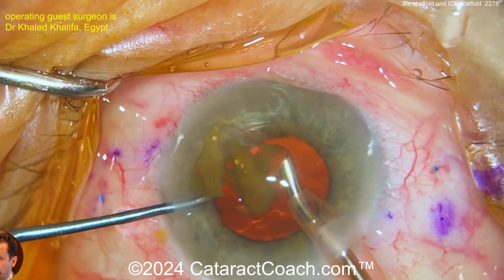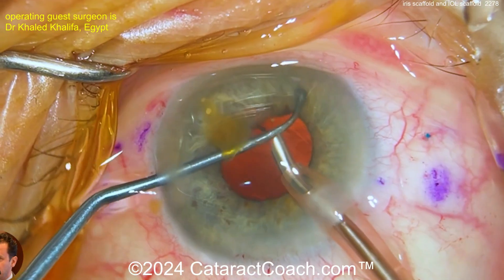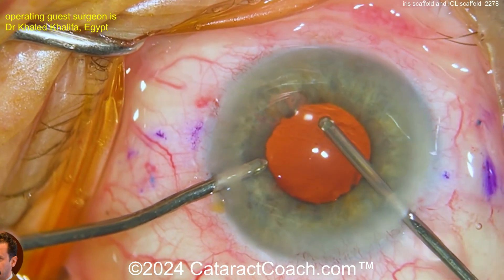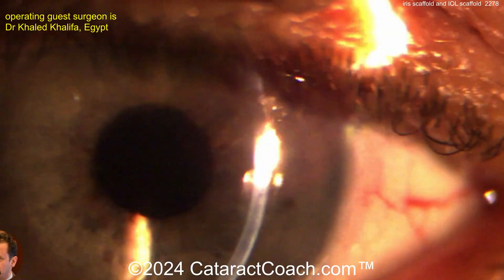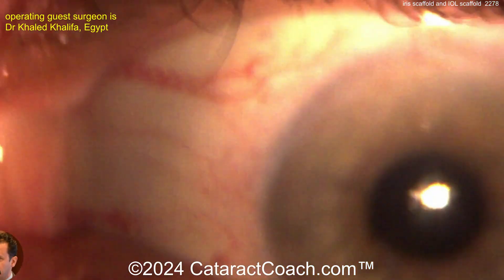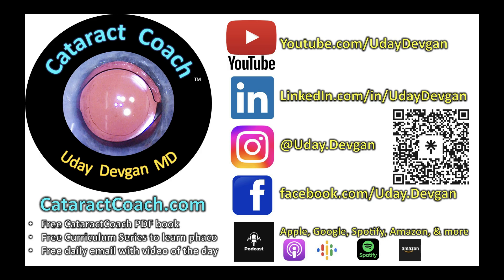So again, scaffold technique here — emulsifying all these pieces. Looks really good. Here's the last piece coming out. Careful to protect the iris — good job. A little bit more anterior vitrectomy. Be careful doing anterior vitrectomy through the main incision because it leaks so much. And there's the post-op look — what a beautiful result for such a difficult case. Interesting iris and IOL scaffold technique. Remember that podcast — every single week, a brand new podcast. Check out our website and download the free Cataract Coach PDF book.